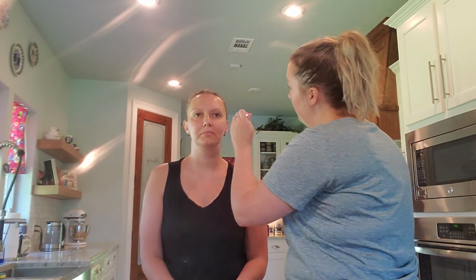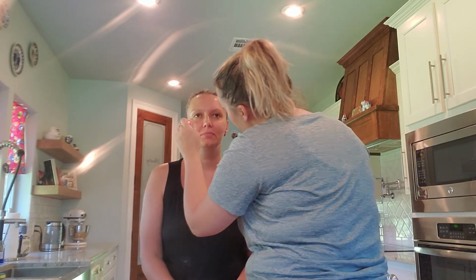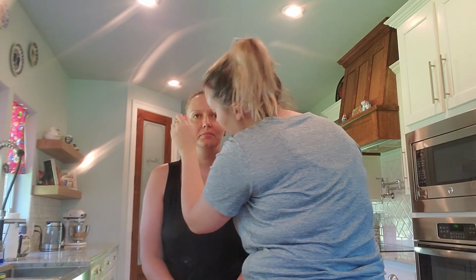Okay, now I'm going to inspect the internal structures of the eye. So I'm going to use my ophthalmoscope, inspect the internal eye, and observe the red reflex. The red reflex is visible. The red area is round and regular with borders.